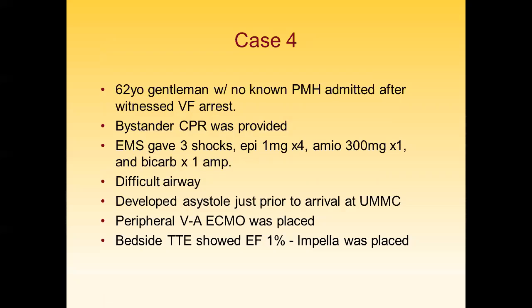So this is something that, because again, we had literally said to ourselves and to everybody else in the cath lab, in 10 minutes we're going to call it if she doesn't come back after repeated shocks. We've given her everything. We've given her 10 minutes of perfusion plus medication onset. And at the end of that 10 minutes, still not recoverable. So it was either turn off the ECMO and be done, or try this one thing that had worked in our lab on tape.